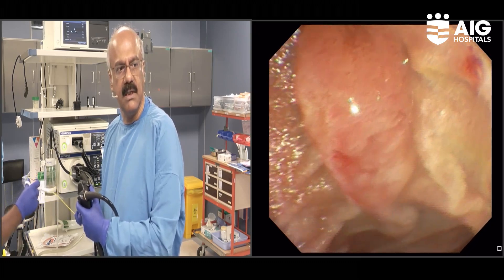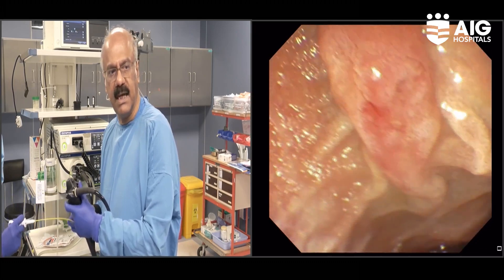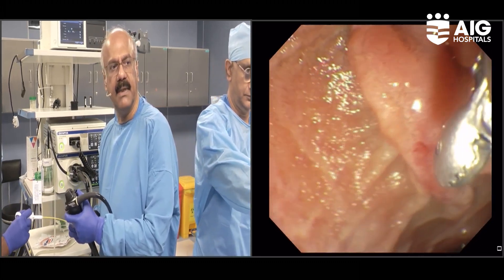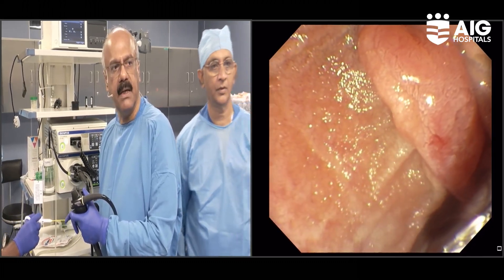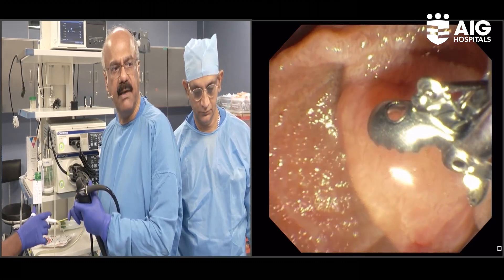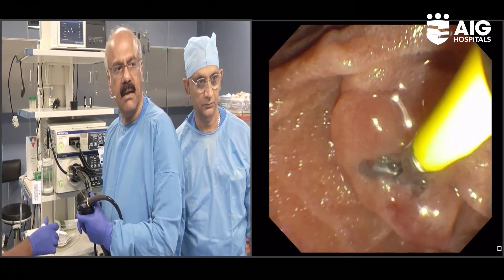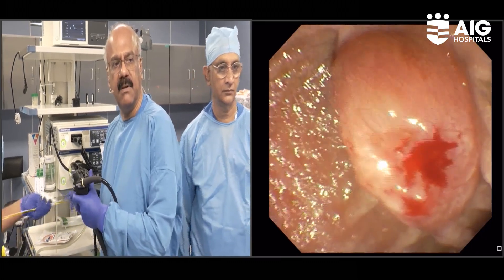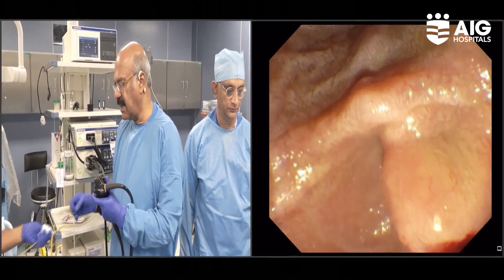I'm using a standard biopsy forceps which we use for upper GI. It's a little stiff when you use it on an elevator here, but we'll get it up there and then go to the area where I suspect there's some pathology, open, and take biopsies directly. I'm using my big wheel to get close to the papilla, to the ampulla, and then insert the biopsy. A bite is taken from the suspected area, and we are sending it over.